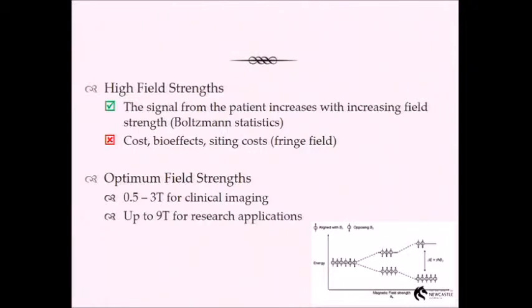No, the answer is no, but when you talk about stochastic effects, you have to look at these things over a long amount of time. And I don't think that MR has been around long enough to say that it's completely safe. So I'll give you an example.